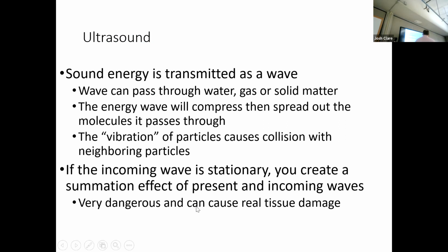So the sound energy is transmitted as a wave. It can pass through water, gas, or solid matter. The energy wave will compress and then spread out molecules as that sound passes through. And that's what we saw with that glass. You saw that glass kind of shrinking and expanding and shrinking and expanding, having that wave-like appearance to the glass itself. So that vibration, that compression and expansion of these molecules is causing a collision with neighboring particles, and that's going to create the effect that we want.